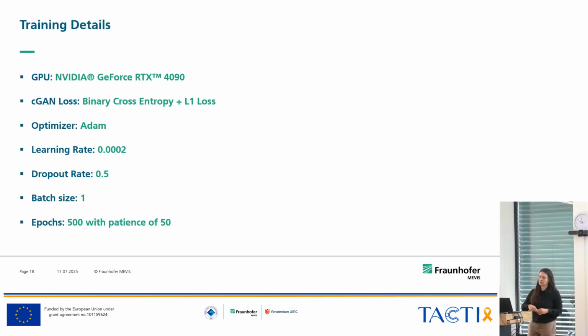But now I'm also doing augmentation, meaning I'm artificially producing movement, and this would be even better, because if you used this clinically, you wouldn't have to see which encoding steps have artifacts in them and then take them out. It would be more feasible to just take the data set that has movement in it, so I'm using augmentation for artificial movement right now. But it's pretty fresh, so there are no results yet.